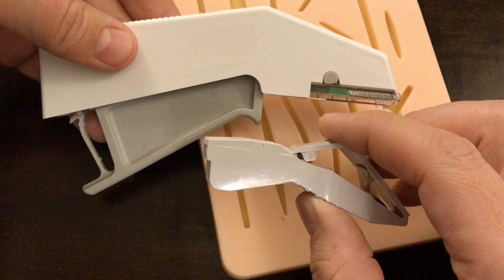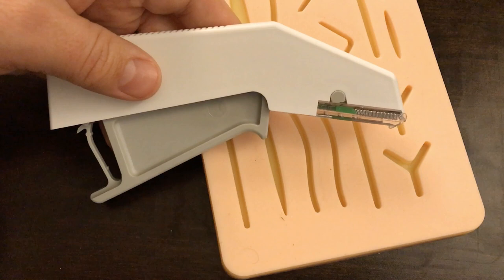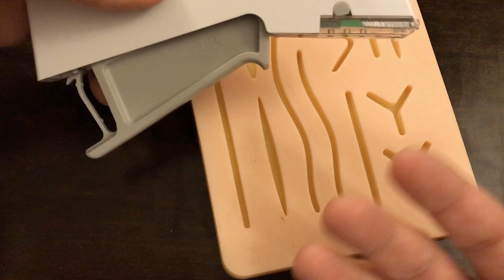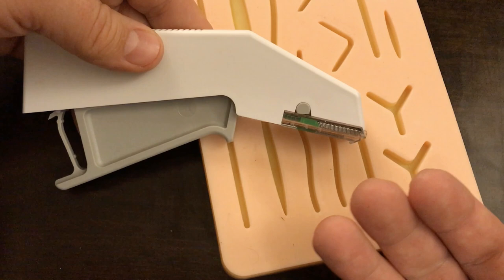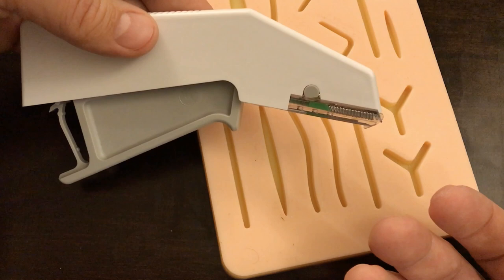My preference is the larger stapler because I feel like I have better control over it and I like the way it leaves staples in the skin — you'll see why as I demonstrate. Before I demonstrate how to place the staples in the laceration, I want to talk a little bit about why you might choose to use a stapler instead of suturing, because there are many advantages and disadvantages to both.